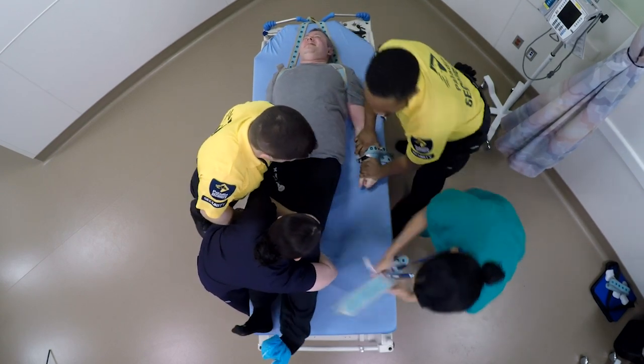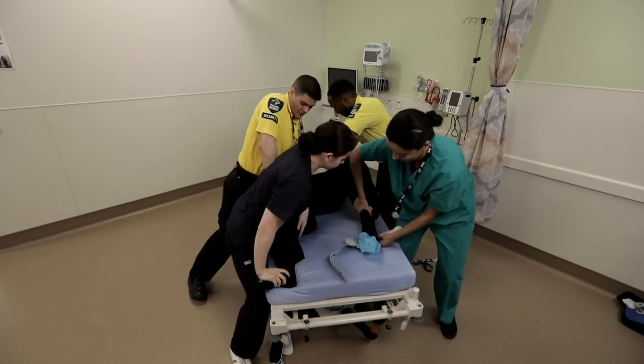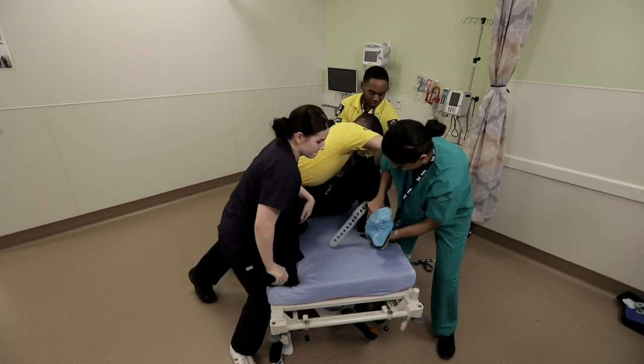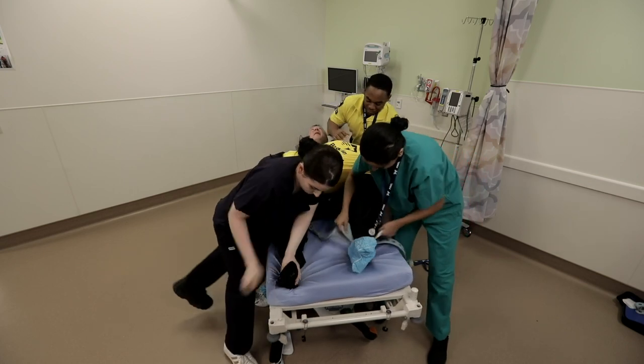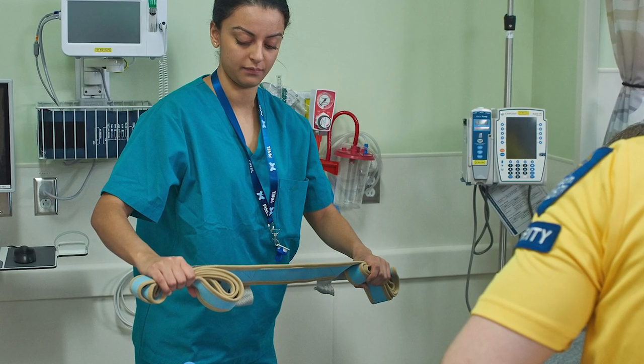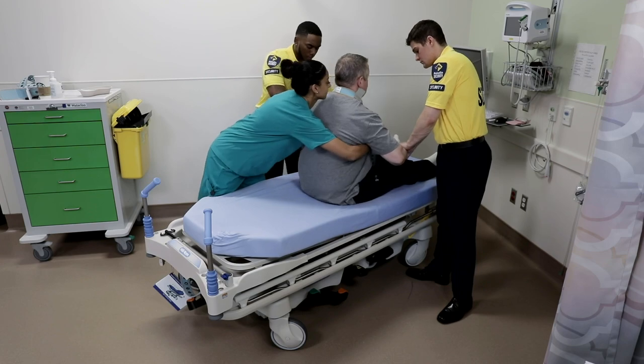If possible, the team leader should position the torso control belt even before the patient is placed onto the stretcher. This belt can assist in dragging the patient to the head of the bed or stretcher. In preparation, the team leader folds the ends of the torso control belt so that it can be easily tossed over his shoulders.